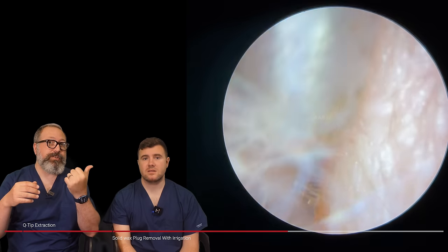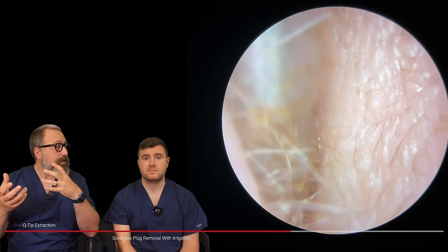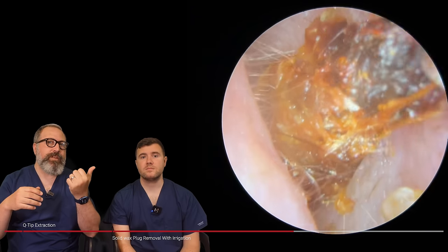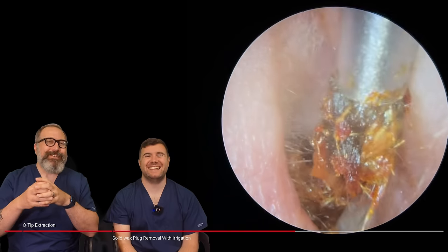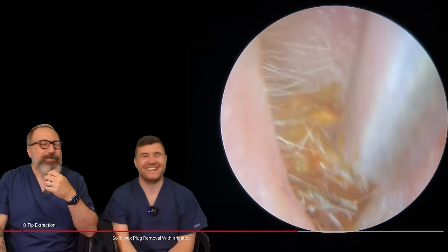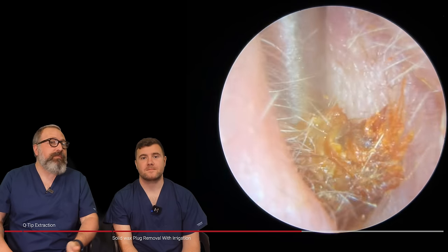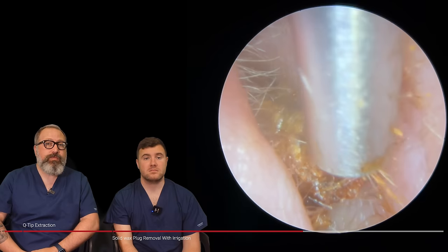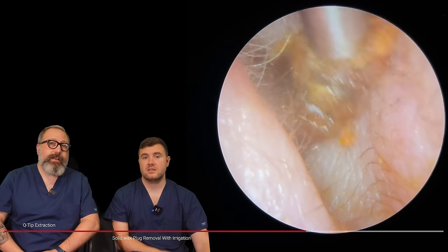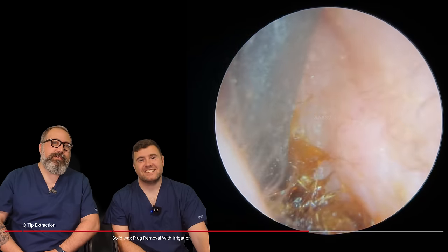Me and Taylor do this all the time as we look at each other's videos, which I personally find really helpful. Because there are certain things that you would do that maybe I wouldn't have thought of — approaching it a different way. We actually do shadowing days in clinic as well — I'll follow Taylor around for a day. It's almost like peer reviewing each other live in clinic, which I find really, really helpful. And you can see it's coming away really well. I think this is the Jobson horn — yes, the Jobson horn.